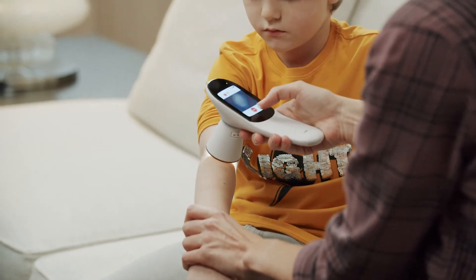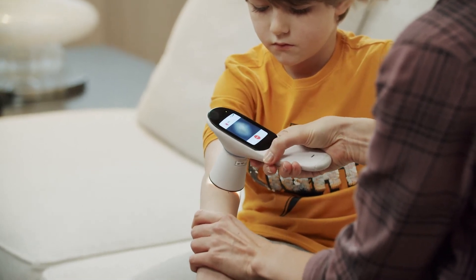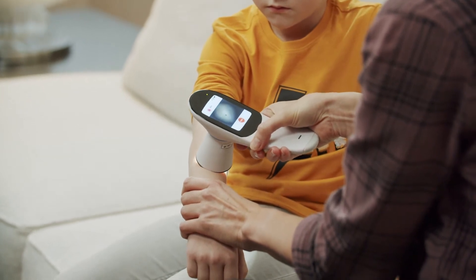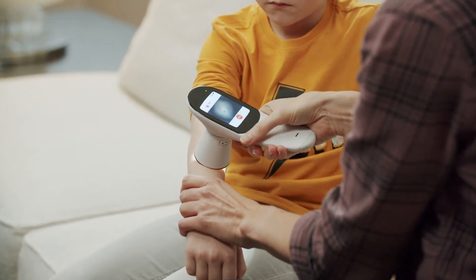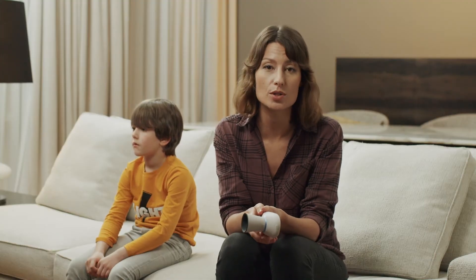After placing the module on the skin surface, press the start button. During registration, you may move the device over the skin surface in order to accurately visualize the entire diseased surface. Remember to keep the module on the skin as much as possible.